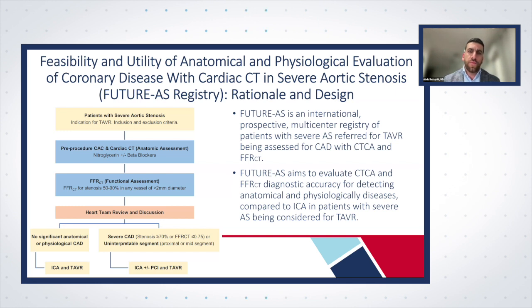So we've built on some pilot work that we did during my time at Monash Heart in Melbourne, Australia, led by Dr. Brian Coe, one of my mentors and PhD supervisors, where we gave GTN in around 30 patients with severe aortic stenosis, and we found that actually it was well tolerated. Now, it was a small study, but we wanted to reevaluate the safety, the feasibility, and the accuracy of properly optimizing TAVR-CT to assess the coronary arteries, and then subsequently also consider its utility with FFRCT. So that's the overall premise for the study.